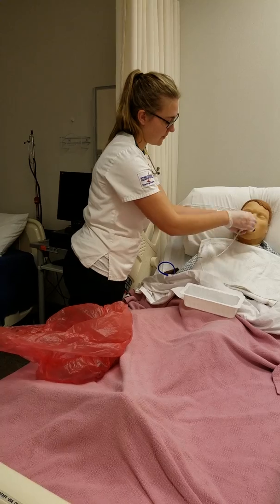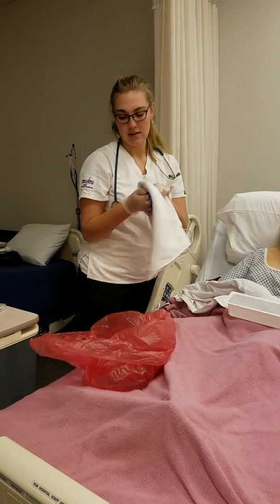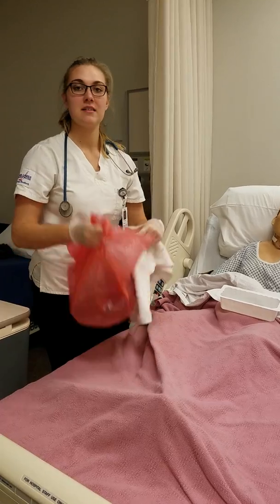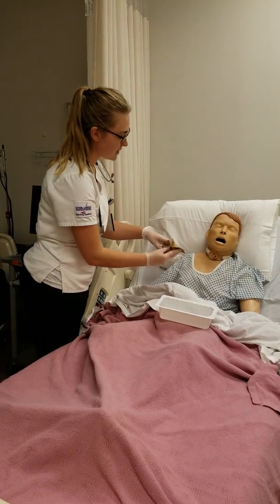Hold your breath. I'm going to pull this out. And I just reversed. And I'm going to place it in the towel, and then into my biohazard bag. I'm going to place my biohazard bag into my biohazard bin, and then my towel into the dirty laundry. Here's this if you need to blow.